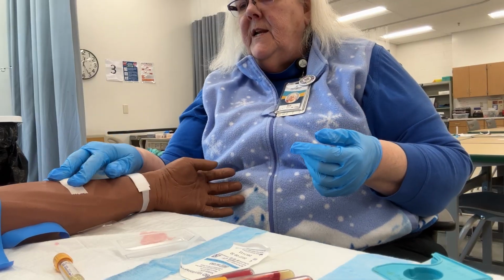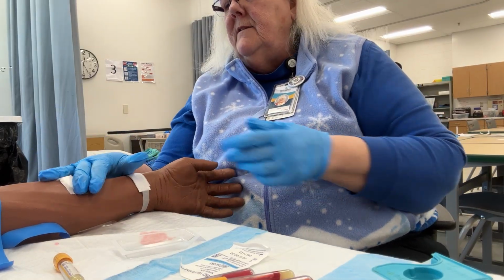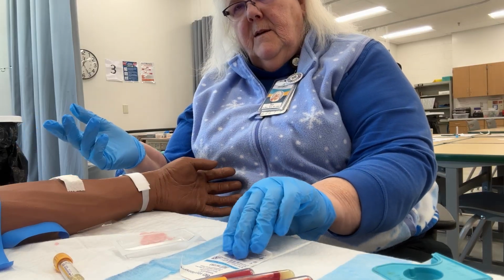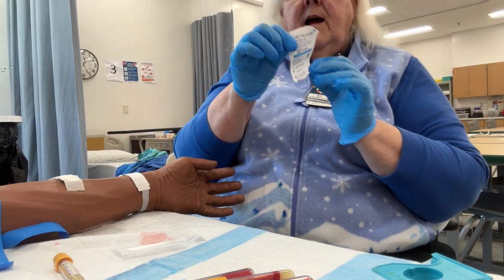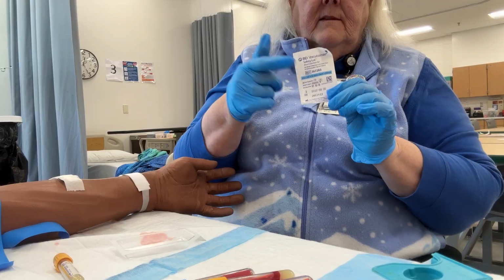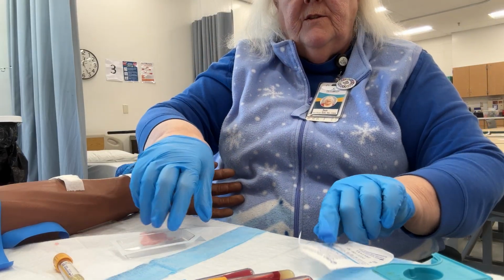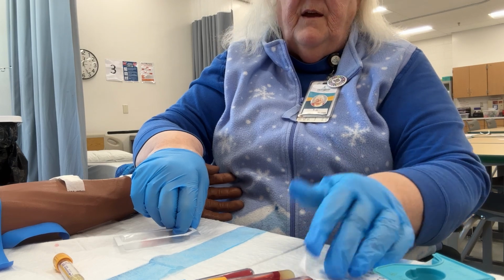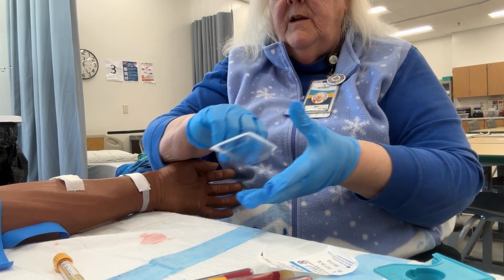Okay, so now I've finished. I will instruct my patient, leave this on for about 20 minutes, unless they're on a blood thinner, then I'll tell them to keep it an hour. I do keep my slip to use for my documentation so I know what type and size of needle. Put that in the chart. That way if there was ever any recall, I would know.